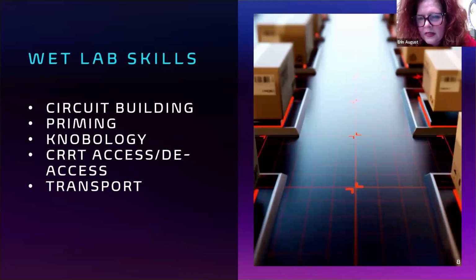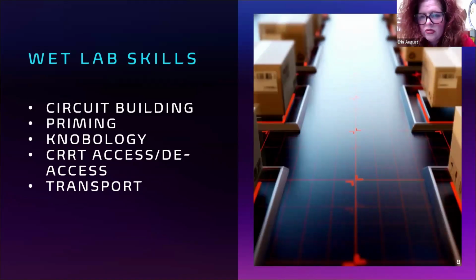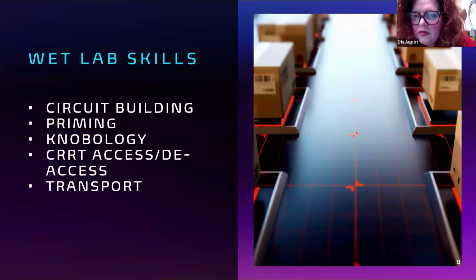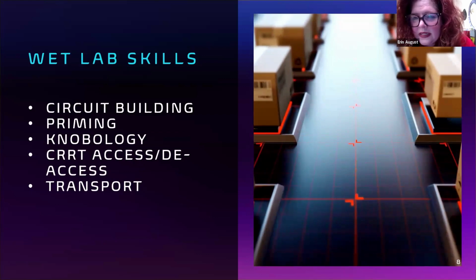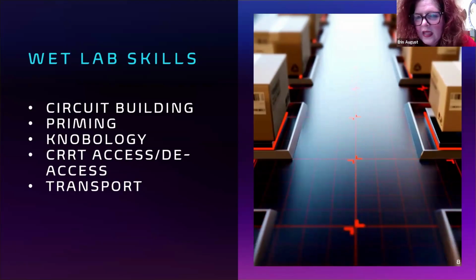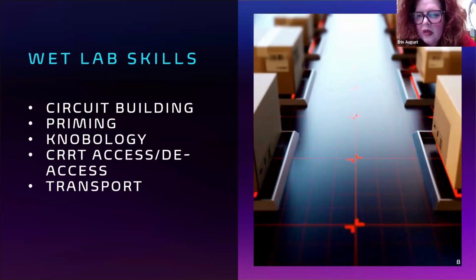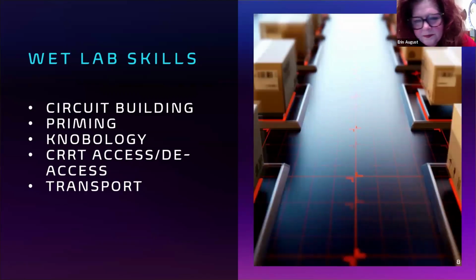CRRT accessing. Some centers choose to run their hemodialysis off of the circuit. Some choose not to. Sometimes it's based on just beliefs. Sometimes it's based on the type of console that you use, whether or not you want to hook up or not. We know there's many different places that you can access. The safe zone per ELSO is post-pump pre-oxy. And we know in a CardioHelp, the way it's made, that there's only one way to access because a lot of people do not cut in a different place for that. So they just go pre-oxy, post-oxy.